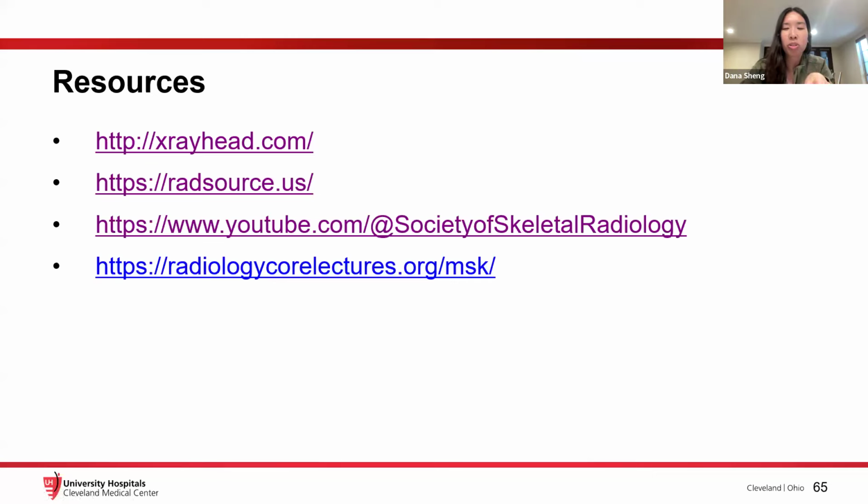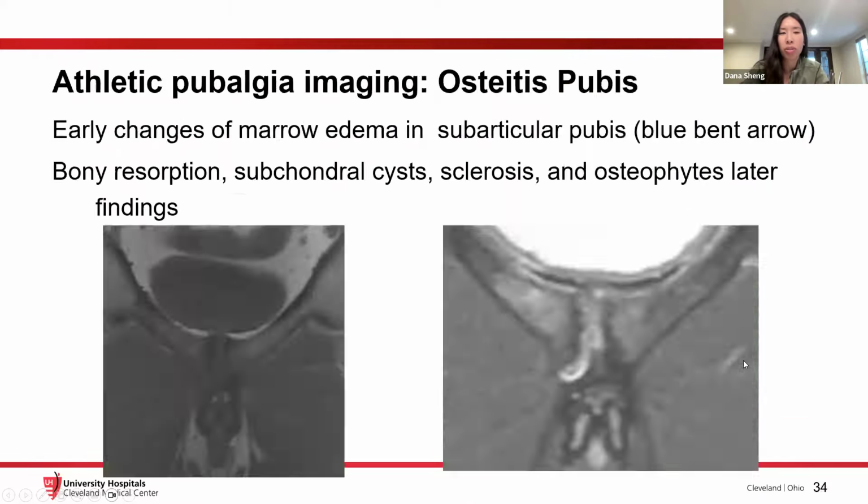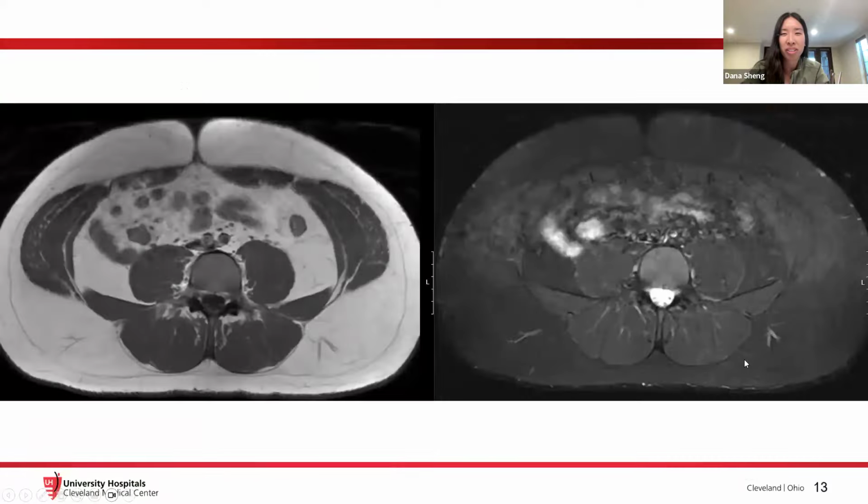I really enjoyed seeing the T1 and T2s side by side. So thank you for doing that and telling us the T1 is really good for seeing tissue planes, nerves, and also showing us how to measure the alpha angle and the TTTG distance. In the beginning, you talked about how you had the FAI sequence and the hip fracture AVN protocol. Do you ever have anyone order both?